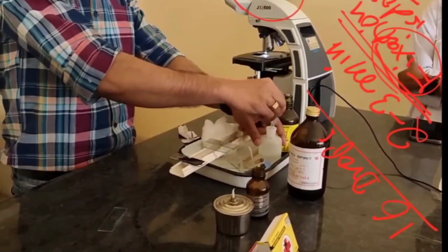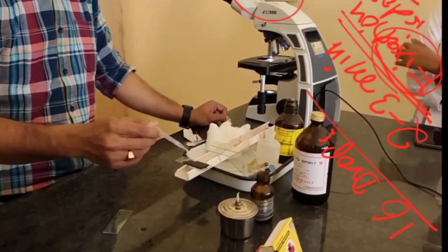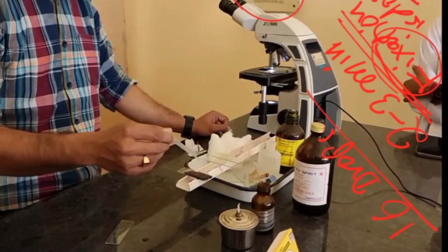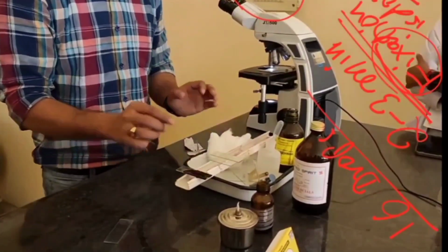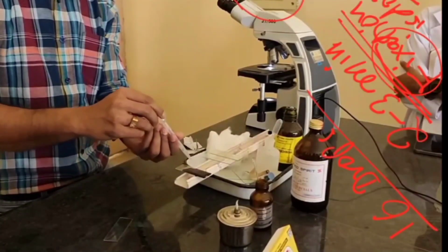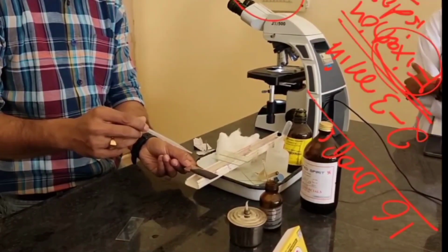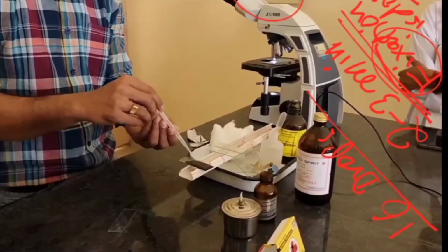It's already 3 minutes, so I waited the maximum time. You can wait 2 minutes or 3 minutes. Now I am adding 5, 6, 7, 8, 9, 10, 11, 12, 13, 14, 15, 16. So 16 drops we have to add. Now it's done, and we have to mix it. We have to mix the distilled water and Leishman stain so that both solutions are mixed properly and the solution will be ionized.